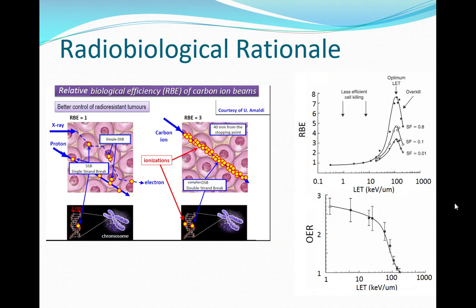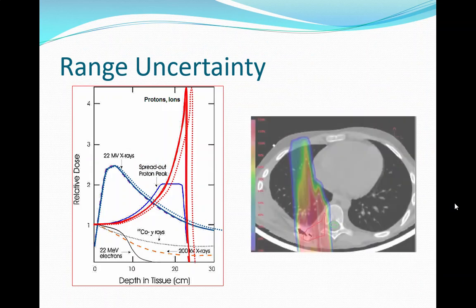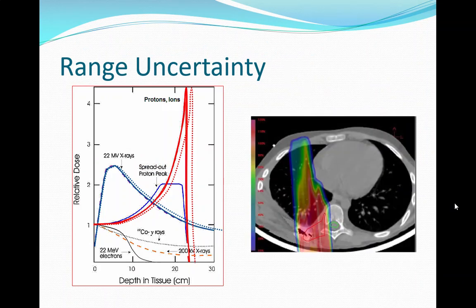Gives you essentially your curves. So it's harder to tell for protons and for ions because of this tendency to double strand break. In any case, you combine these, right? It's highly effective.